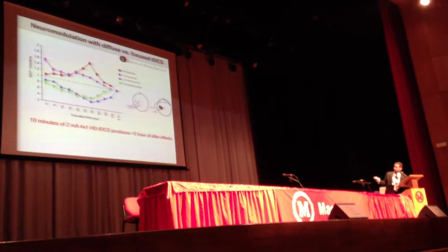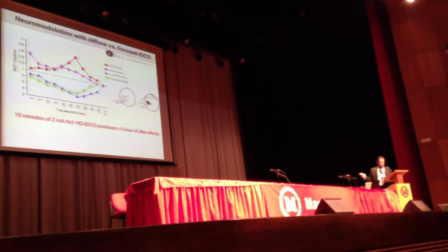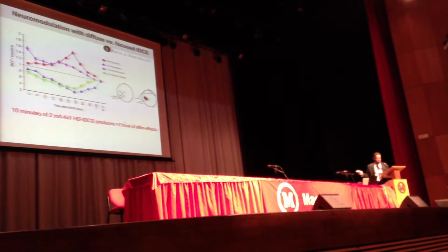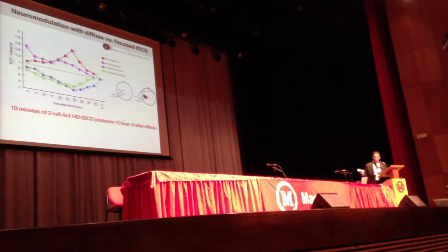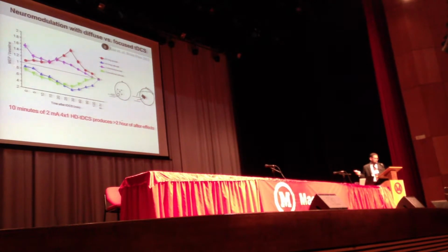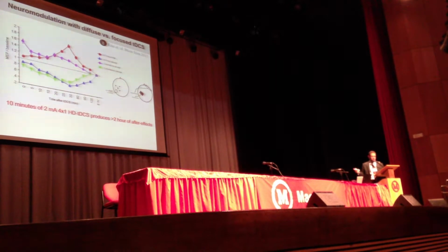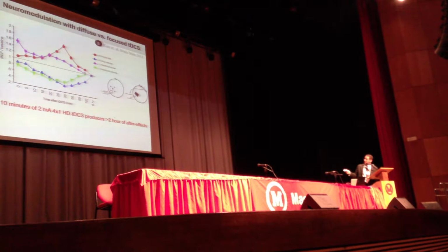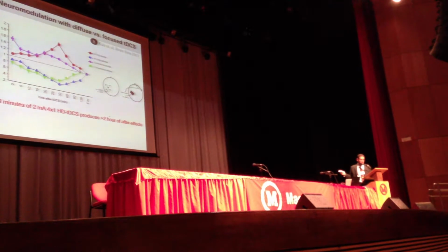And just looking at the anode case here in the purple, you can see that conventional tDCS with a pad montage produces this typical initial excitation that then decays back to baseline. The 4x1 montage produced a very different profile. Immediately after stimulation, there was actually no significant effect when averaged across subjects. But over the course of the next 30 minutes, the magnitude of this modulation accelerated such that it was maximum at 30 minutes. And 2 hours later, this was still significant relative to no stimulation.